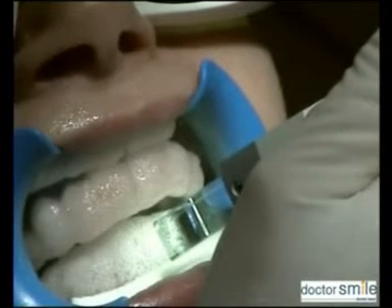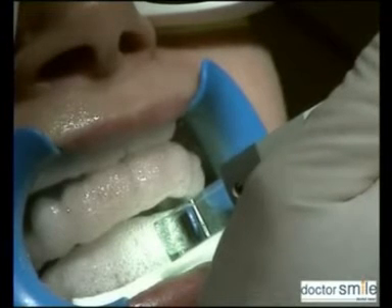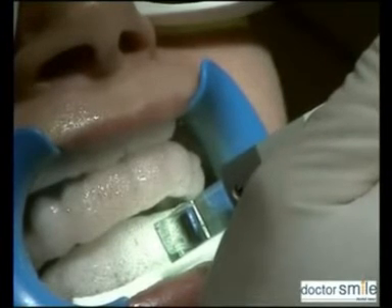Place a new gel layer by suction and repeat the same operation three times as before, respecting the intervals.